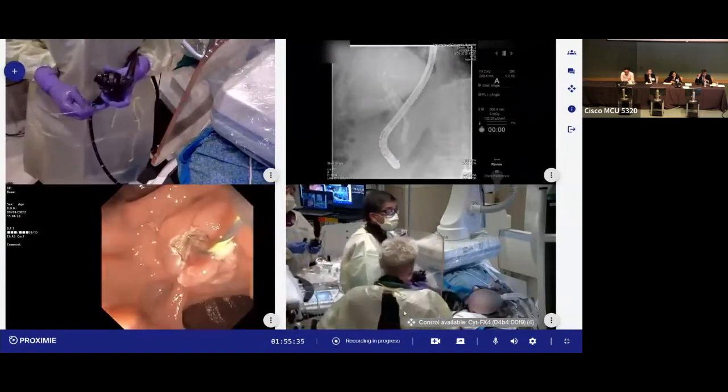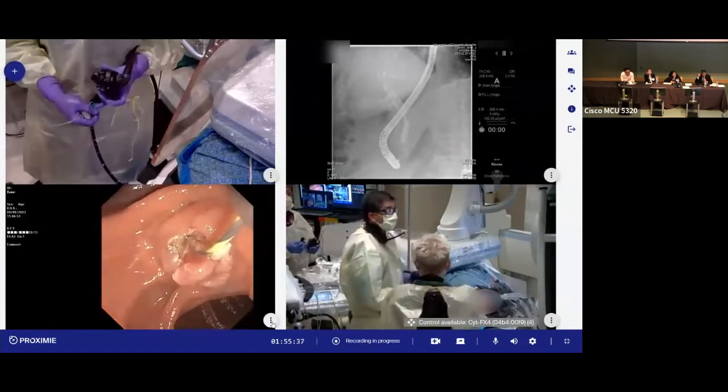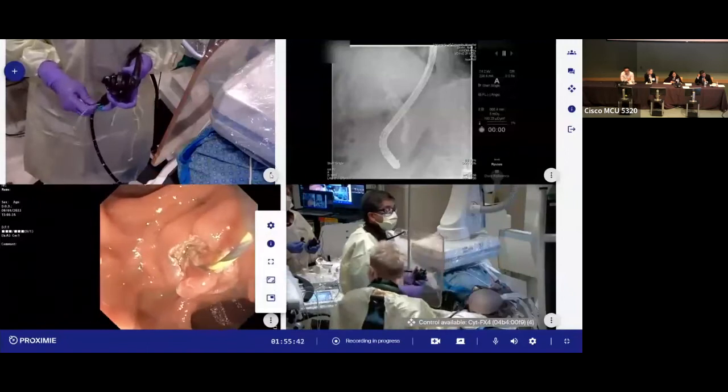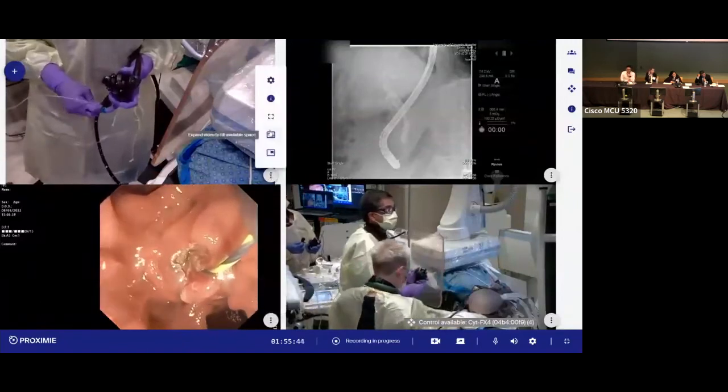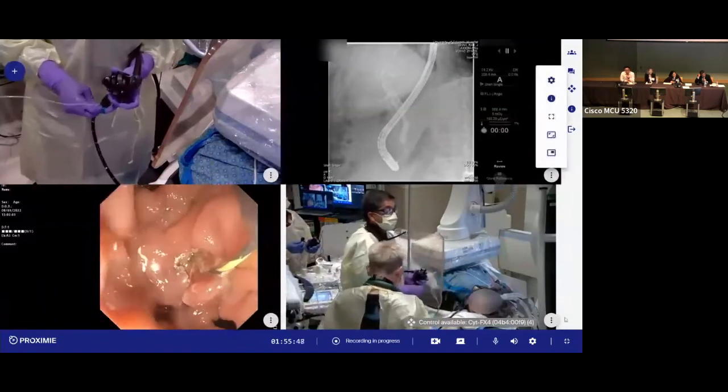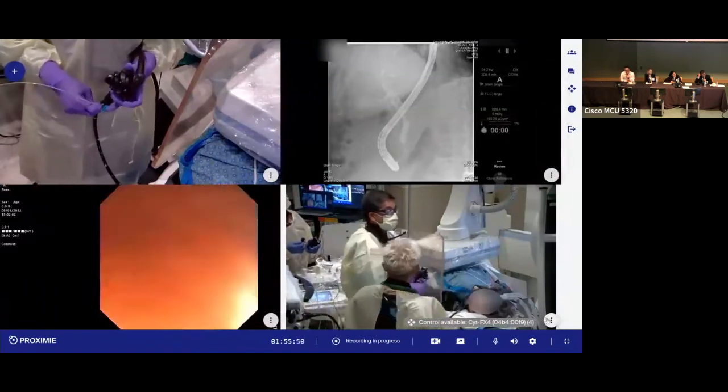Looks like there's a lot of room there. I think you can cut more. Cut more? All right. Why didn't you tell me earlier? I was already doing the exchange. Yeah, no. I mean, I still think you need to cut more. I still should cut more. All right, fine.